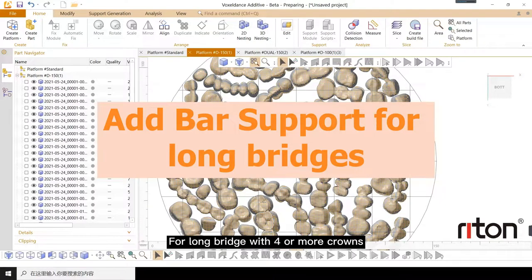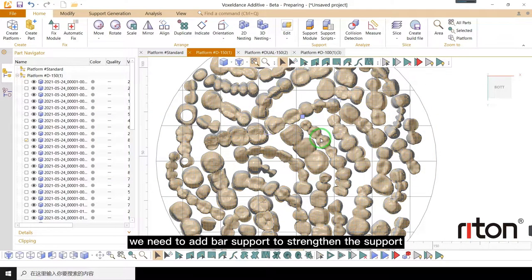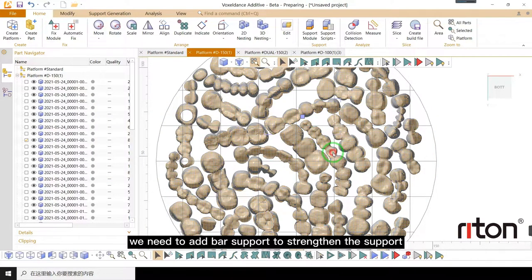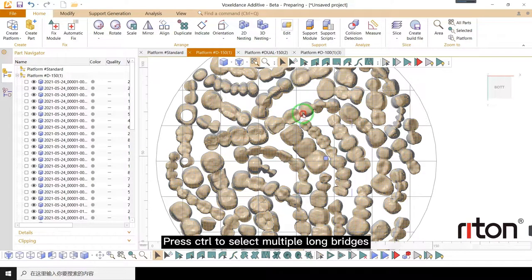For long bridge with 4 or more crowns, we need to add bar support to strengthen the support. Press control to select multiple long bridges.